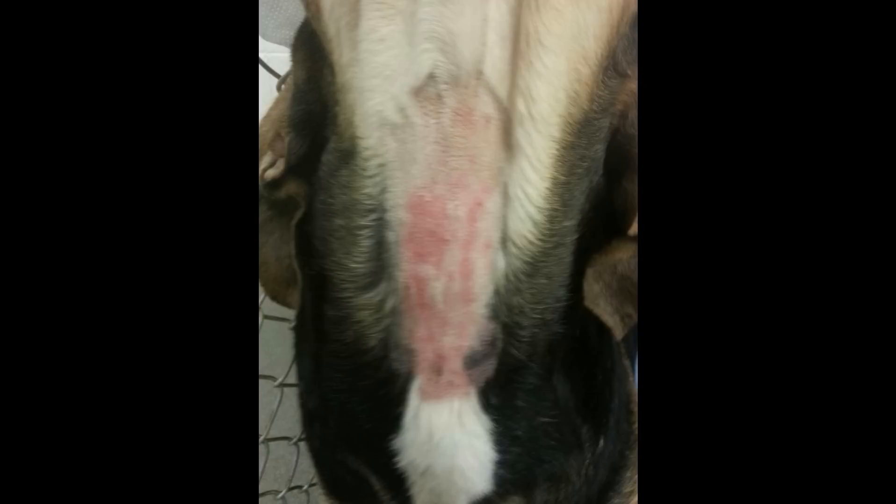At the end of the lab, rinse the neck with paper towels soaked in water and liberally wash the whole area. This is also why we apply Mometamax steroid lotion to the skin at the end of the procedure — it helps reduce this type of inflammation.